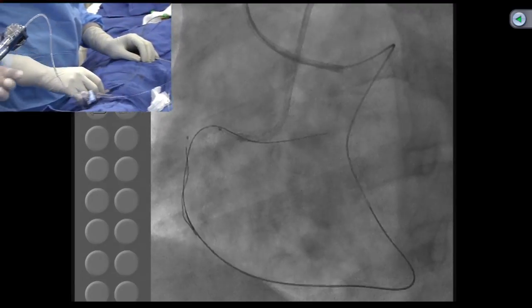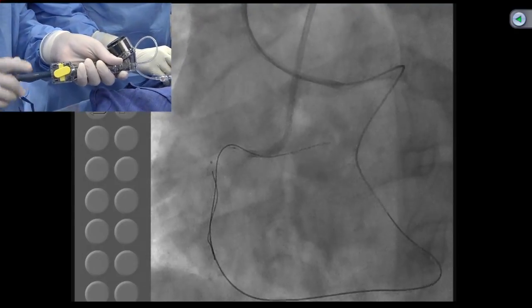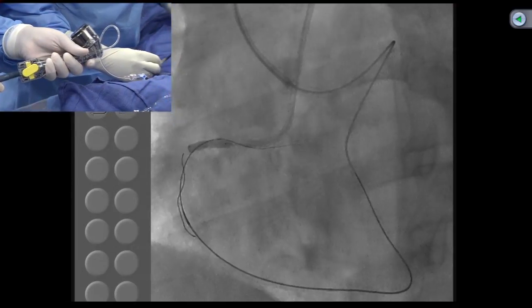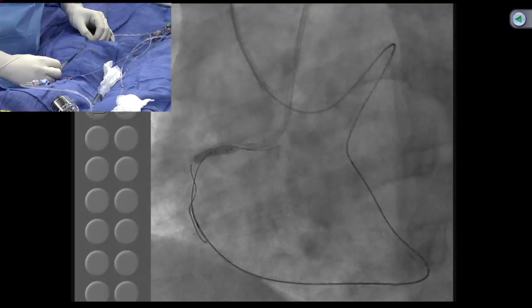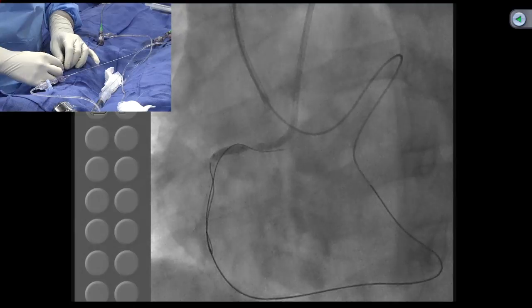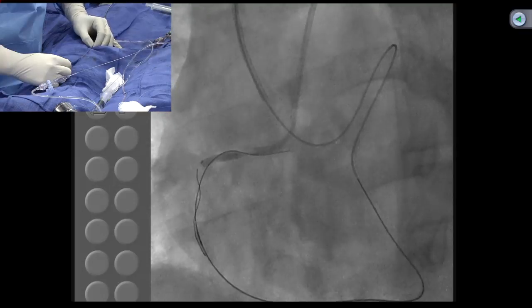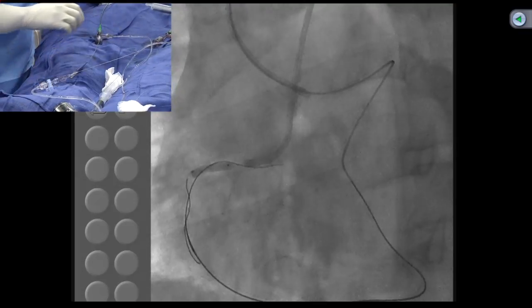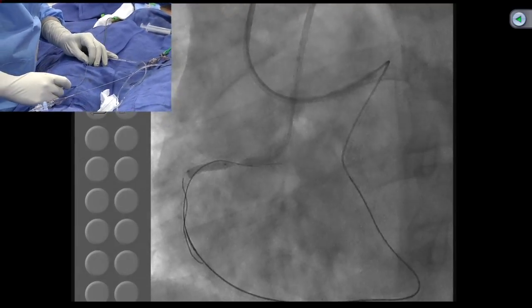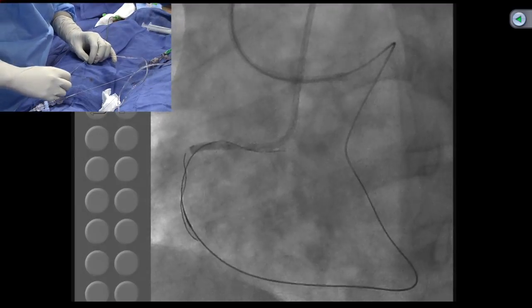So what I did was, it's in the lumen, but get out of the ostium, and it's in the aorta. I'm just trying to get the Corsair sucked in. Corsair has gone through now. Yeah, Corsair has gone through. So let's pull back the Corsair a little bit and we deflate the balloon and try to see the wire into the main lumen.